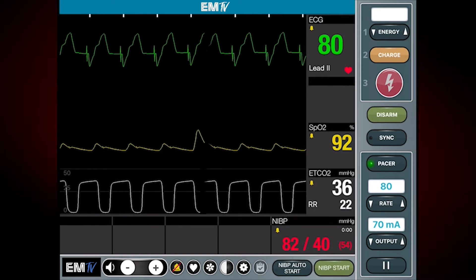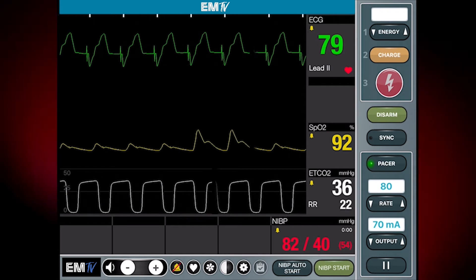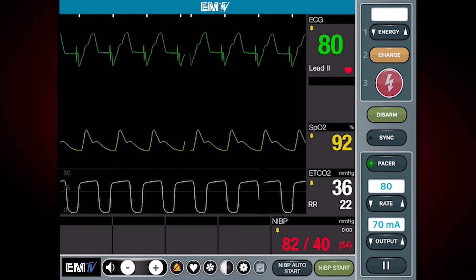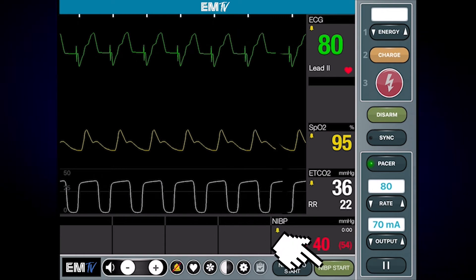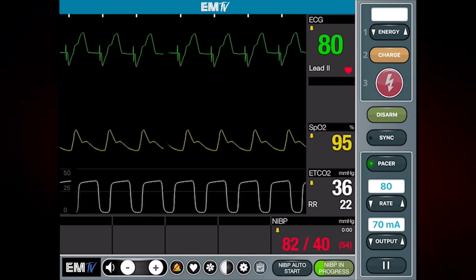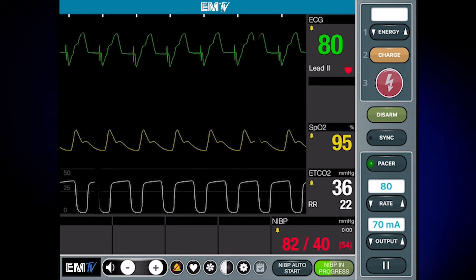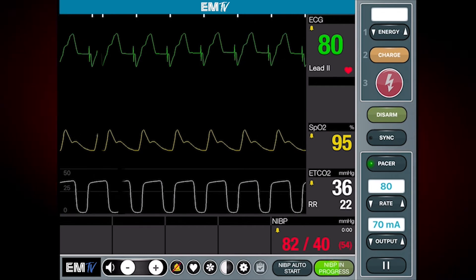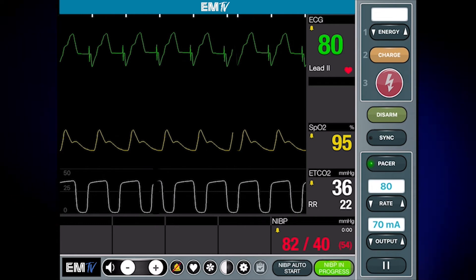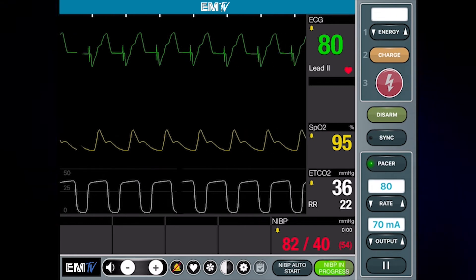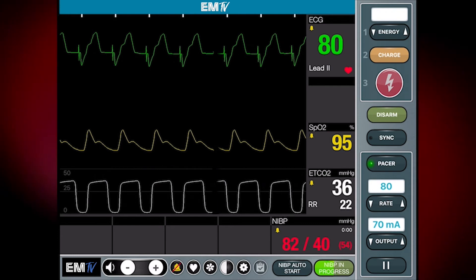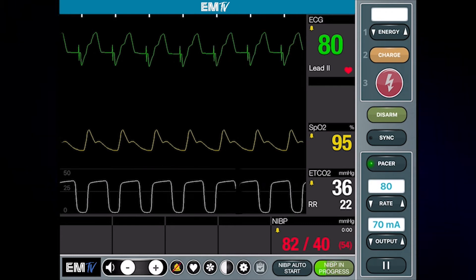I will now check the patient's pulse to make sure it matches, thus assuring mechanical capture. Patient condition and all other vital signs should be checked. If you fail to achieve mechanical capture, increase the milliamperage until an appropriate pulse rate is felt.